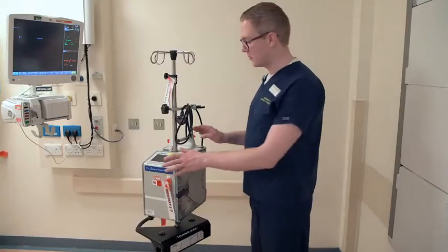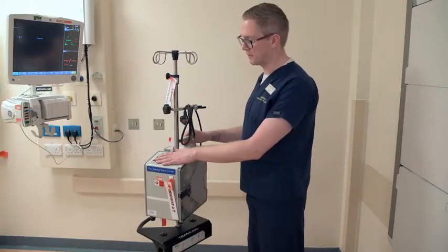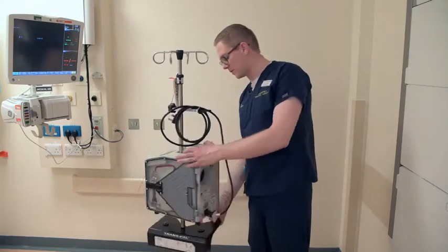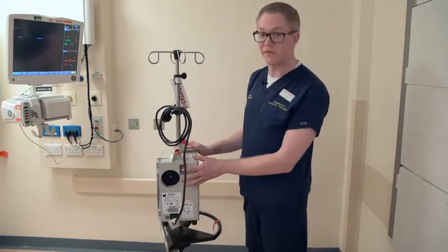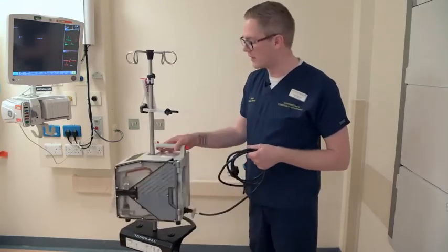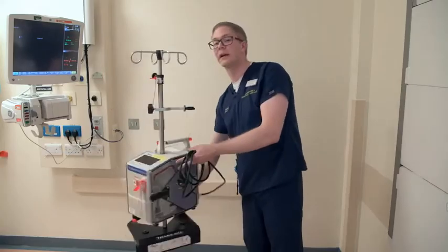Hello, this is a quick video to show you how to prime and run the Belmont. This is the Belmont — we have the touchscreen at the front of the machine, the cassette holder on the side, and on the back of the machine you've got your on and off button, which you do have to press quite firmly to get it to hold, and you have your power cord, which should always be plugged in for the Belmont to operate as it should.